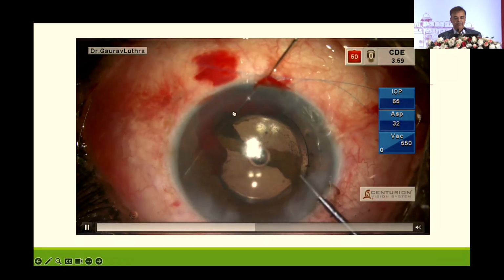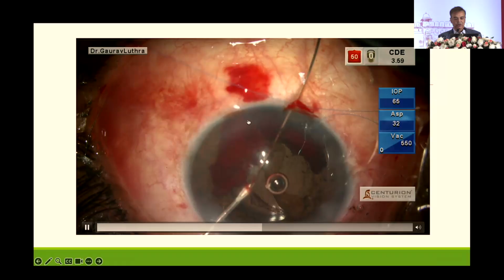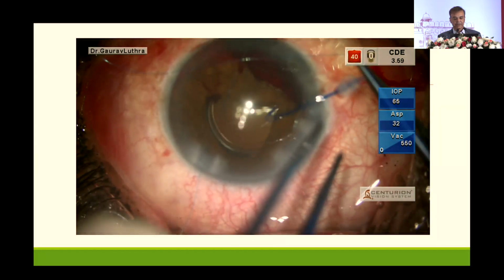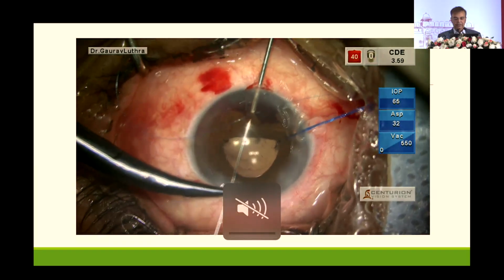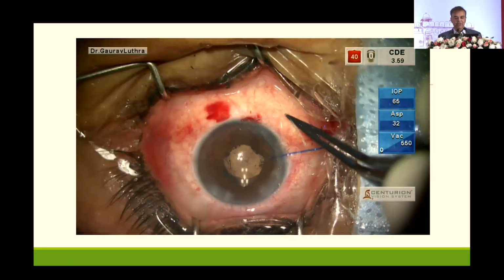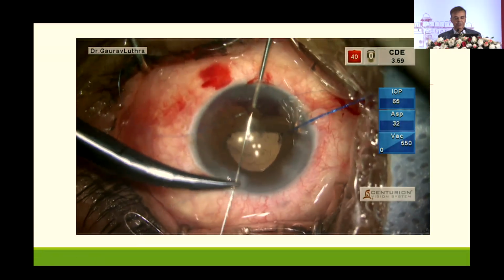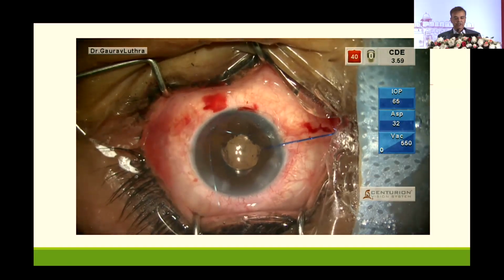And I have a big hyphema which has started from the root of the iris, and the dialysis seems to have increased almost by half a clock hour over here. So now I'm going to use the modification which I felt would help us, because you should always either be holding the iris which requires surgery from the area right next to where you're going to pass the suture, or you can bring in a 26 gauge needle and do a railroad technique as I just showed you there. So you can bring this 26 gauge needle right where you want to pass the suture from the opposite side, and then pass the suture, catch the iris where you want to pass the suture right there, and then through the Hoffman pocket and out.